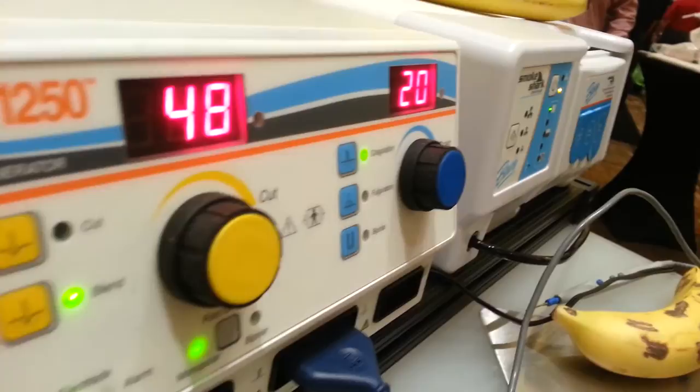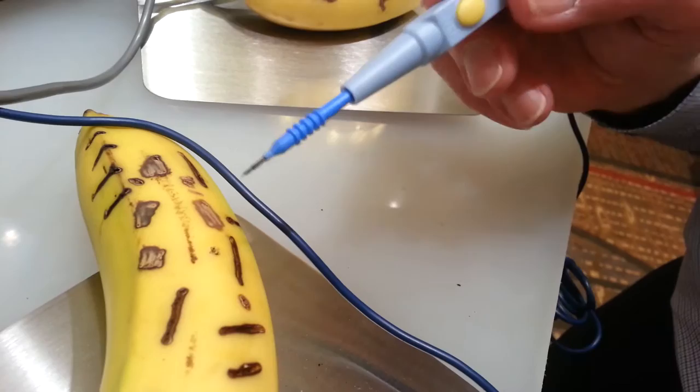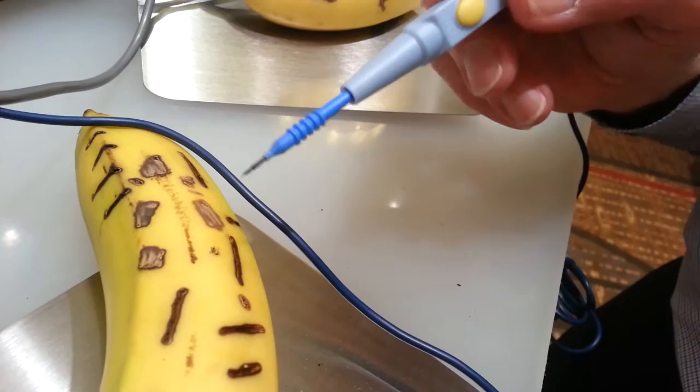I have a pinpoint coag, which is mainly for a big, large bleeder. If I need to shut it down, I would take the tip of my electrode here and put it right on the blood vessel, and I would activate it, and it would allow me to dry out the liquid that's in the skin cell and shut the bleeder down.